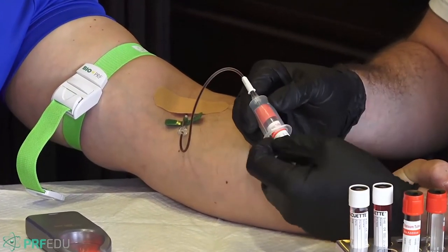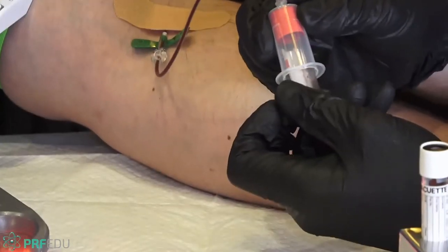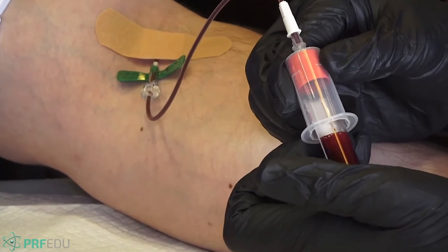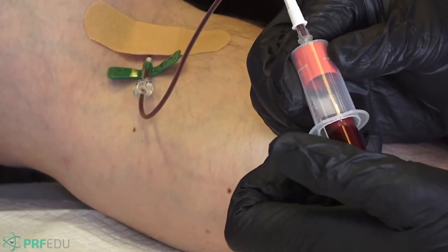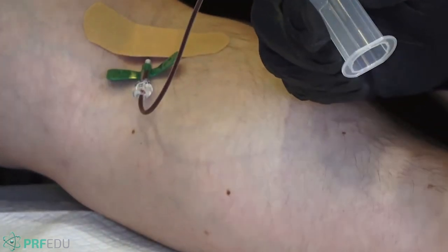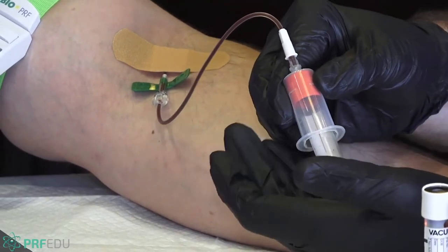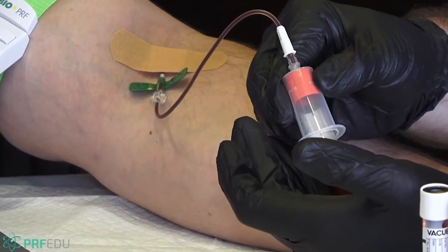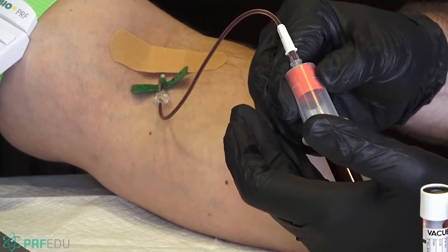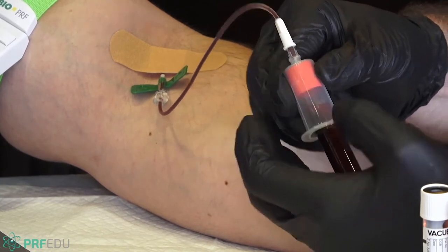So those are the white ones for the liquid PRF. We always draw those ones first. Now these are the red tubes. These ones here are meant to produce the membranes. So they clot a little bit faster because they're made out of glass. And of course, with all of these tubes, we always want to make sure that there's absolutely no additives inside them. Okay, that's very, very important when we utilize this technology, and it's a natural approach. We want to make sure that we're using no additives inside the tube. So both the plastic as well as these glass tubes have no additives at all.